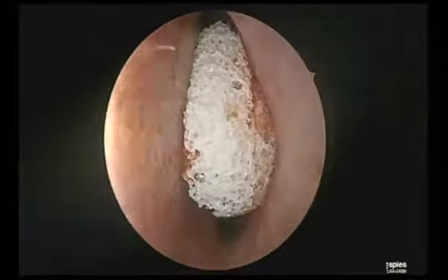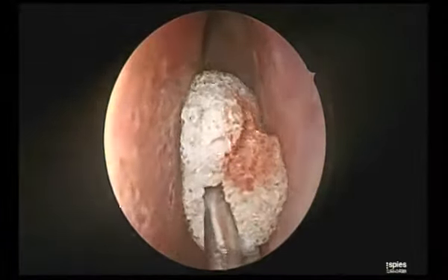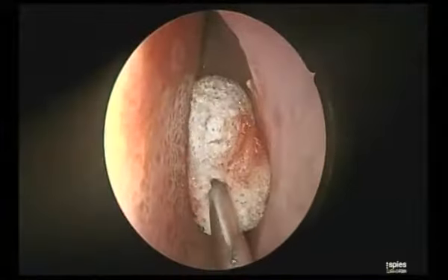That depends upon the age of the patient. This patient is elderly, about 60, 70. So I am just using 1 portion adrenaline, 4 portion saline, and that too topical only. Now the other important part is to reduce the bleeding. Why is it important? Because you need a good surgical field.